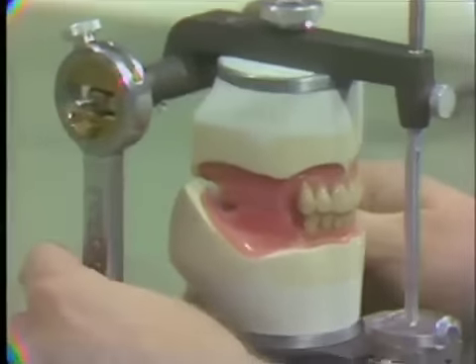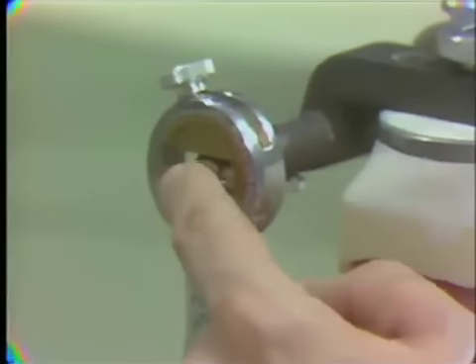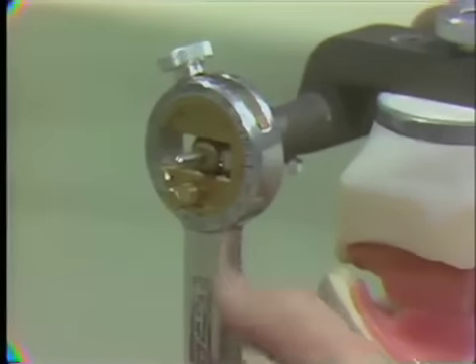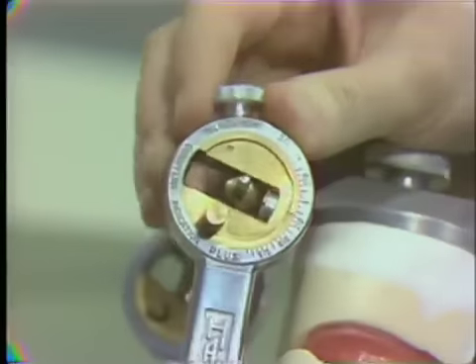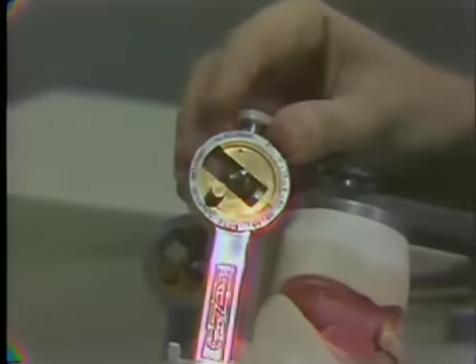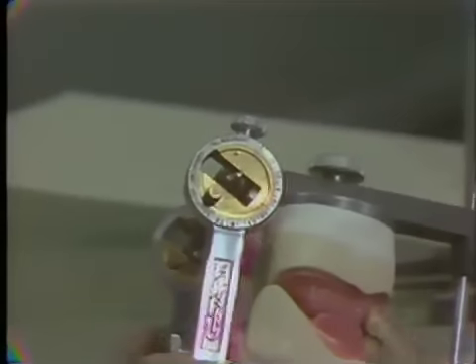The first thing we have to do is pay attention to the inclination of the condylar guidance. Normally we get this registration from the patient through the protrusive check bite, but in this case we will go with the manufacturer's specification of a 30 degree condylar inclination. So set your condyle at 30 and tighten it down. Now that's our condylar determinant.